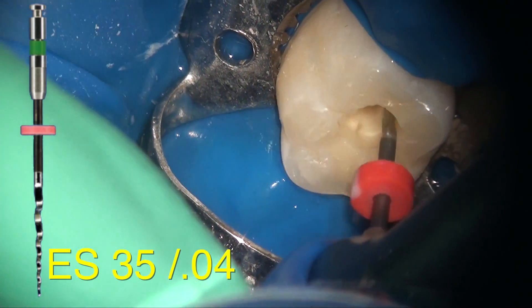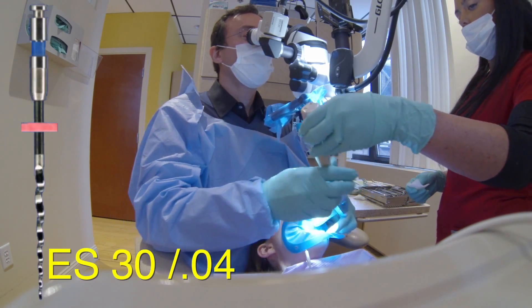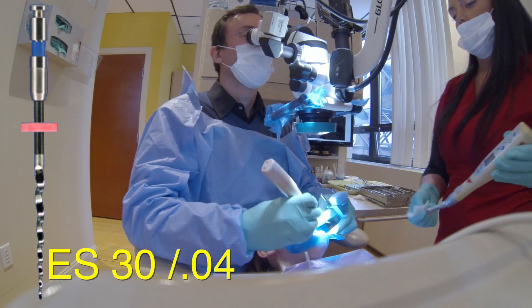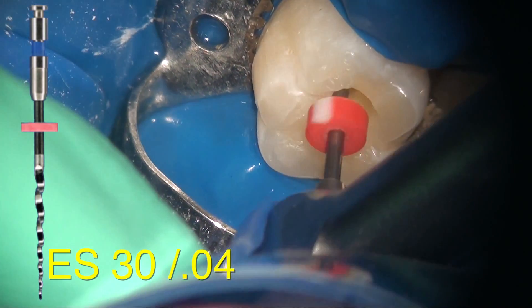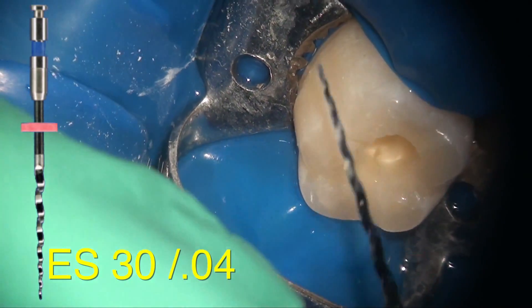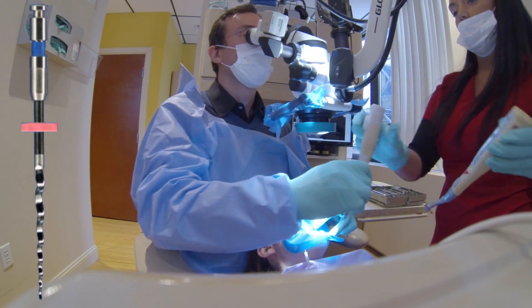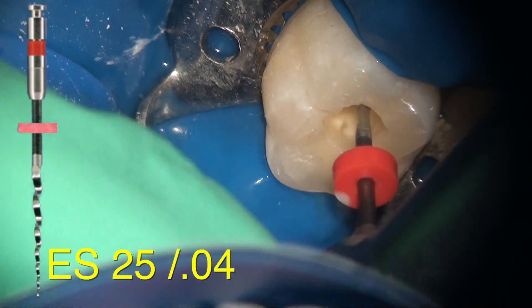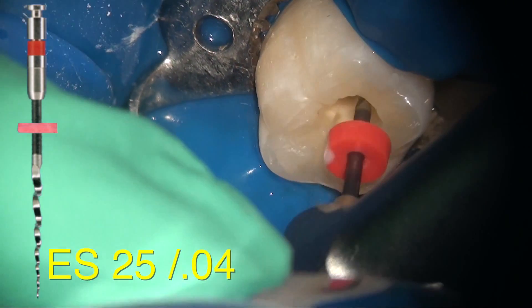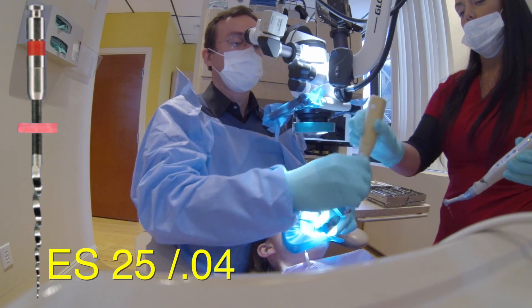Please remember: when I did the size 40, it reached down to about 20 millimeters on the distal root, so for subsequent files I no longer need to instrument the distal root — I've already reached my estimated length and I don't want to go deeper until I measure with my apex locator. Now using the size 30 on both mesial roots with two passes of three, and now the size 25 — you can use the ultrasonic and water with fresh EDTA. The size 25 also reached the 20-millimeter estimated length. It's very important not to be ambitious — just allow the files to go down on their own.